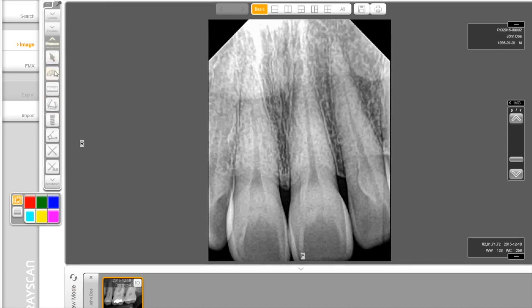Below that, you can do angles under the Measure section. You have a standard single line measurement, and a single left click will start and stop. Also, you can do a multi-line, or tape line, so you can do multiple measurements. Finally, you can put an arrow and draw a line in the image under Annotation. If you would like to change the thickness and color of the line, click the option as shown. Also, you can do polyline and free drawing. And you can put some text.